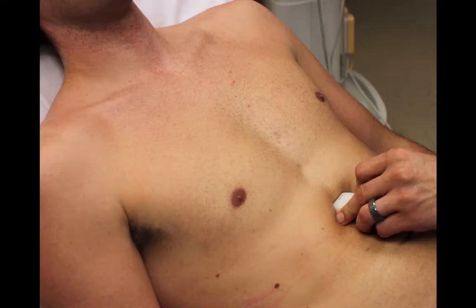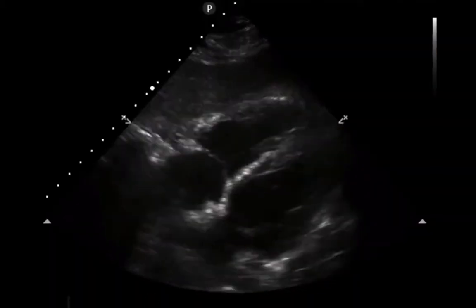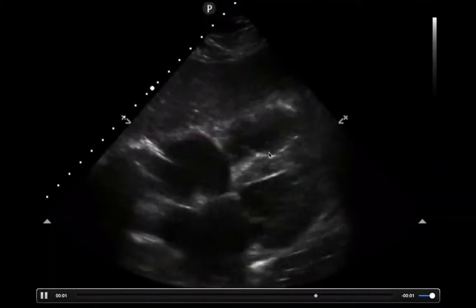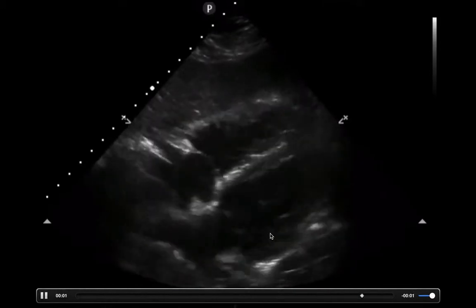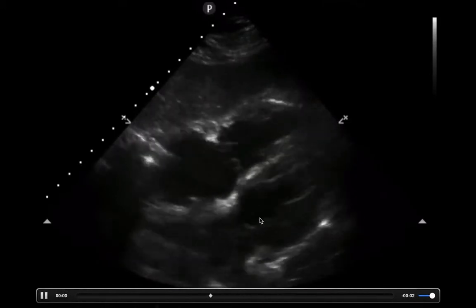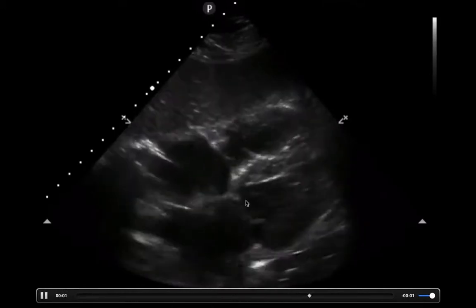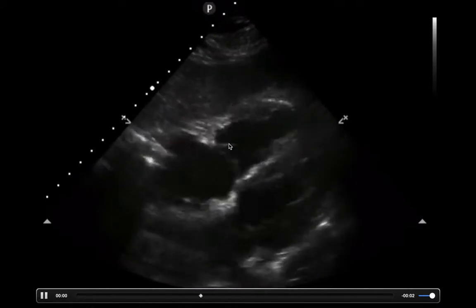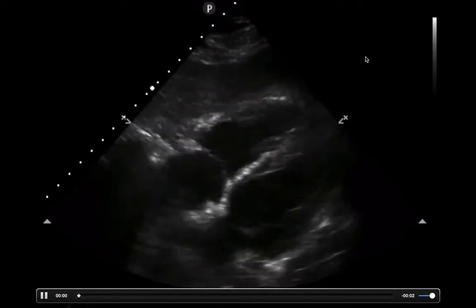Another window you can use to look for right heart enlargement is the sub-xiphoid window. You just take the probe in the sub-xiphoid area with the probe marker facing towards the patient's right, and you'll get an image like this. What you're comparing here is the sizes of the right ventricle and the left ventricle. A normal ratio is the left ventricle should be about two-thirds of the whole width of the heart and the right ventricle should be about one-third.